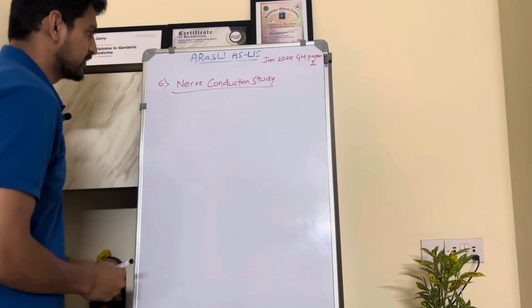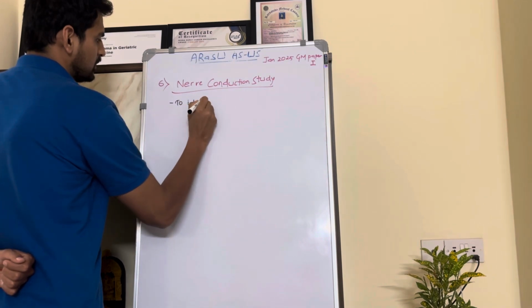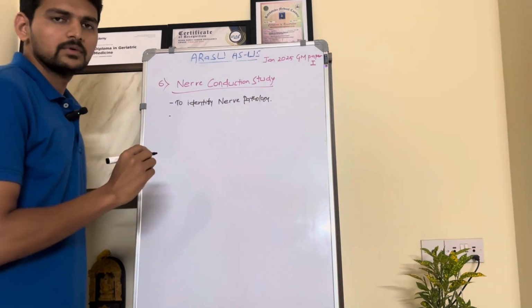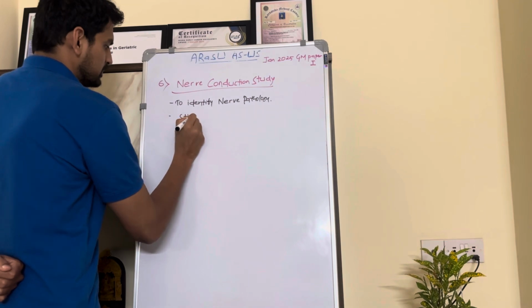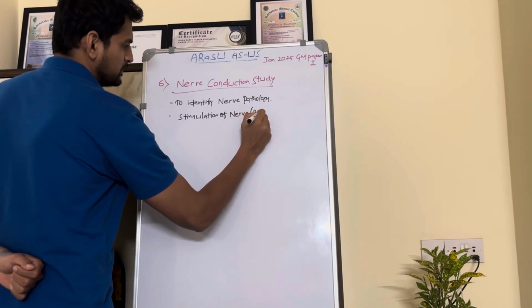Coming to the introduction. Here mainly this procedure is done to identify nerve pathologies. In this procedure there will be stimulation of a nerve, mainly a peripheral nerve.